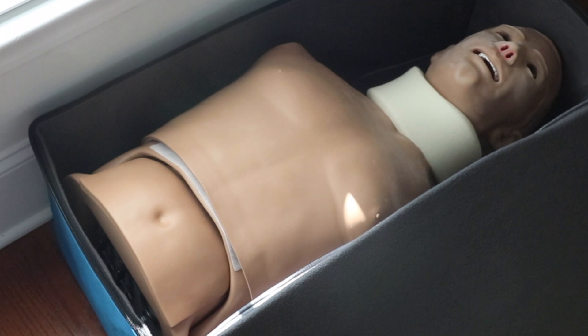We want these mannequins to last a long time. They are extremely expensive, and the longer we can keep these mannequins with us the better off we're going to be, which means more equipment we can buy later on for the EMS program.